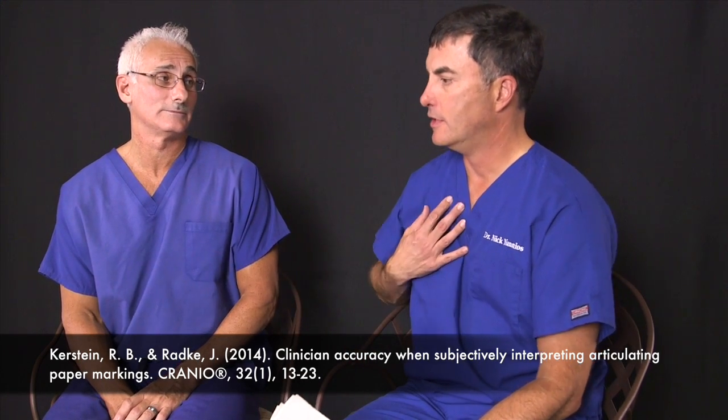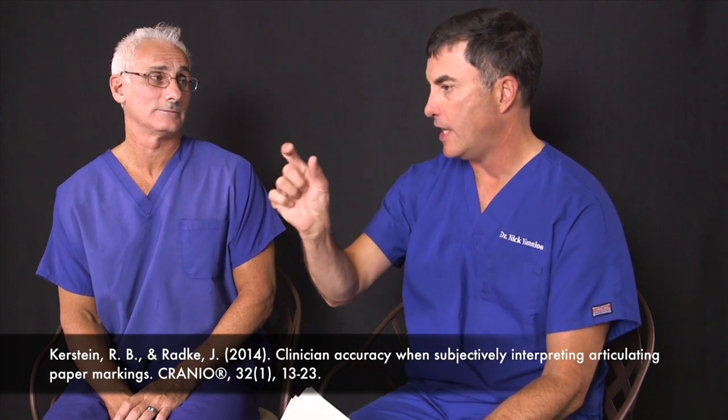So they are criticizing us for grinding on back teeth when we know exactly where things don't quite fit in the part of the machine, but yet they are grinding 8-to-1 on the wrong place themselves. Numerous times. The wrong place. So who really here is doing something that's not conservative? T-scan guided occlusal adjusting is minimally invasive, maximally therapeutic. The reverse for by-eye, paper-only adjusting.